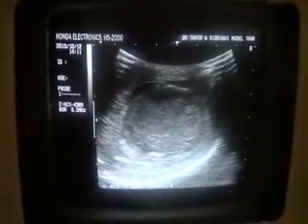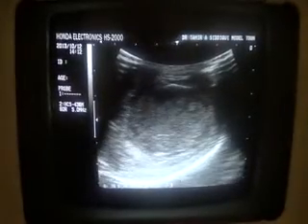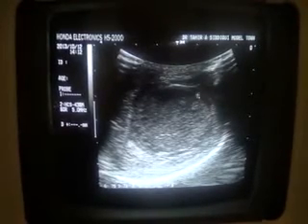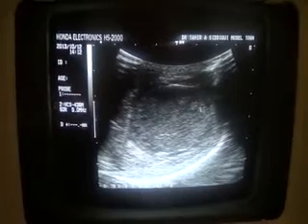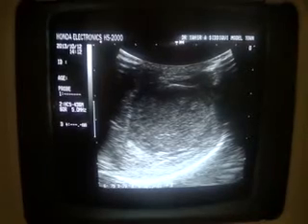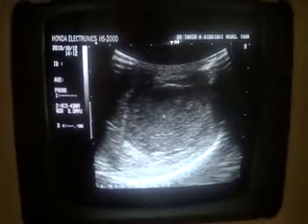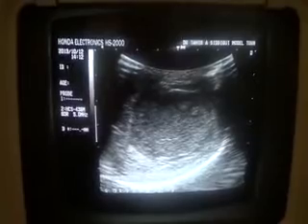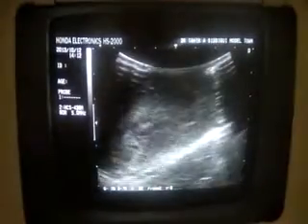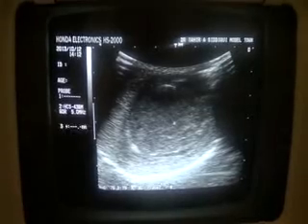The mediastinum testis is not visualized. There are a few focal echogenic lesions. This is an echogenic area surrounded by a halo at the medial margin of the right testis, but this linear structure is suggestive of the mediastinum testis, which is intact. So the testis is not that badly damaged, though there are multiple lesions seen.